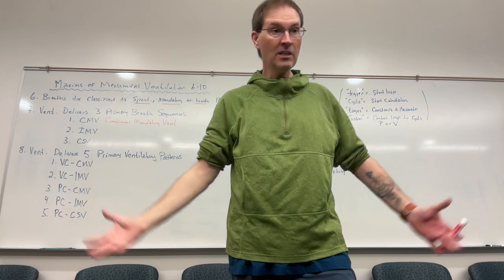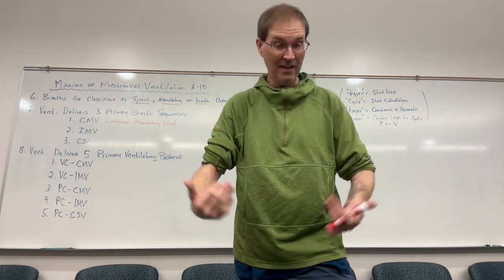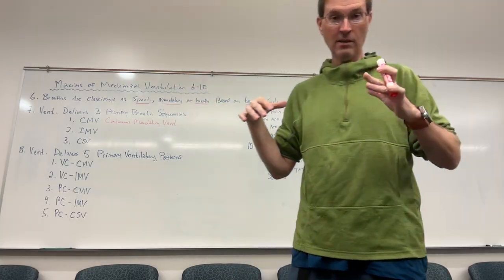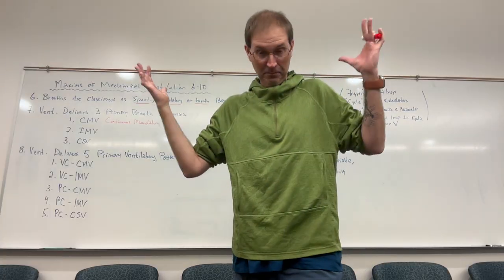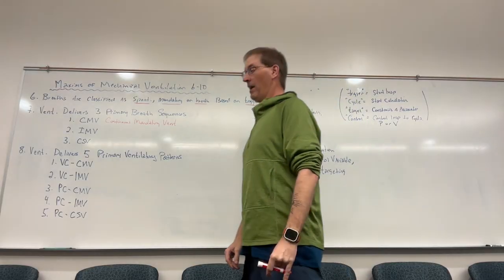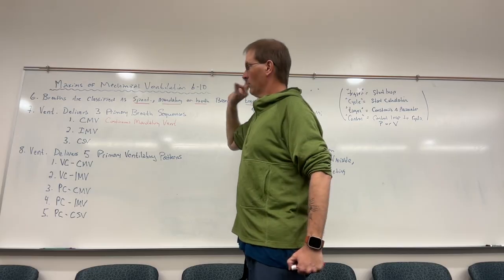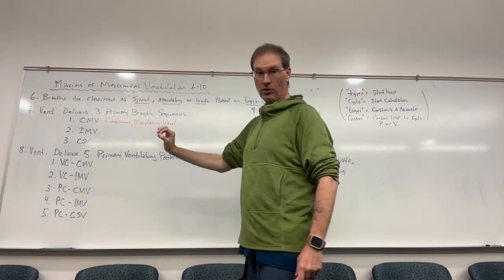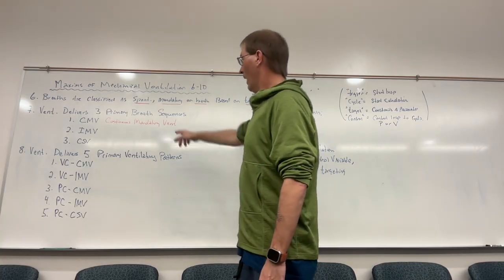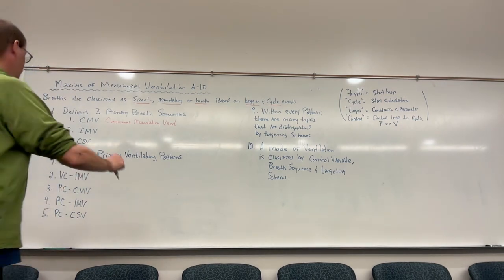And there may be a dozen different individual names for a CMV mode, but at the end of the day, if you're super NAVA extra dextra jelly sandwich mode on your ventilator, if it is a mode that causes the ventilator to deliver every single breath as a mandatory breath where the ventilator's in control, that is CMV, okay? The next is what we call IMV, and that stands for intermittent mandatory ventilation.